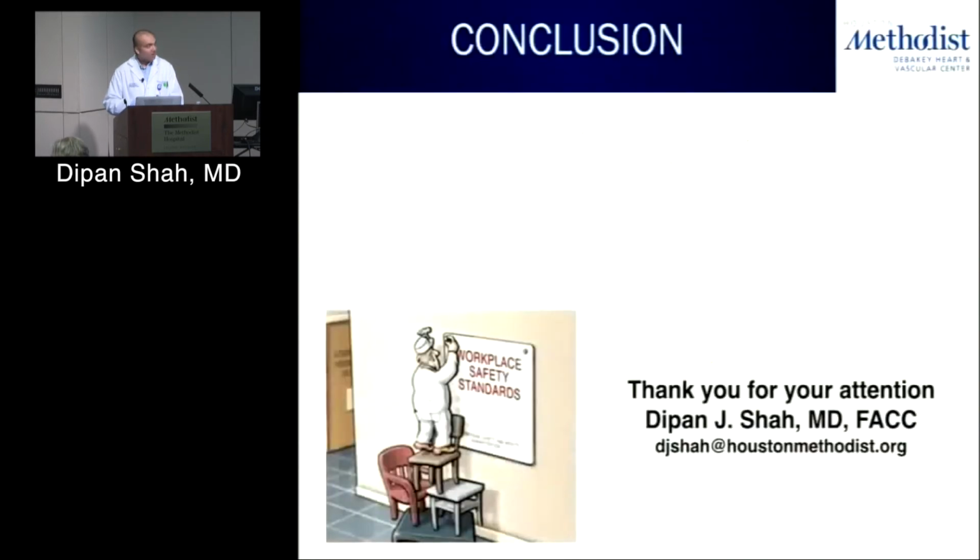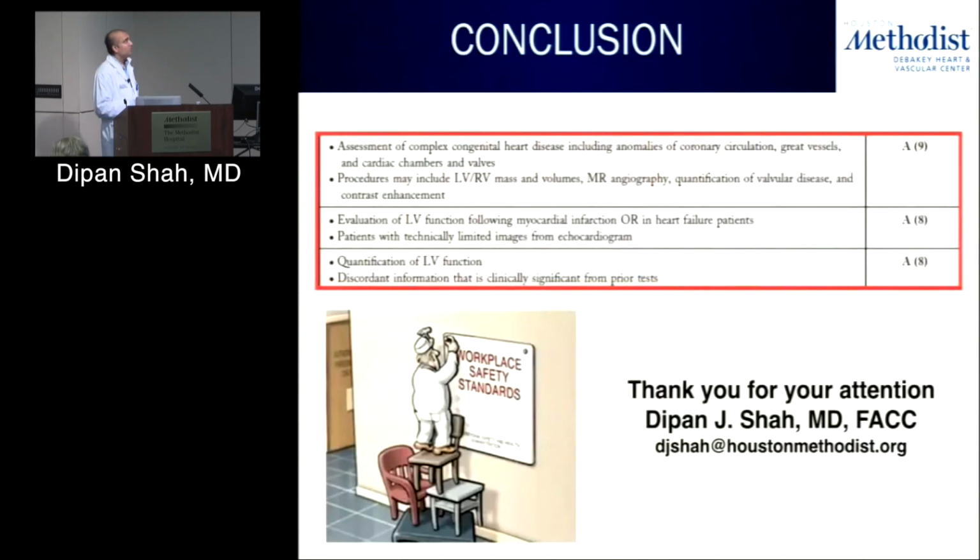So again, to kind of summarize, what's the clinical role of CMR for LV function assessment? Obviously, if you've got a situation where you need to quantify LV function and you have discordant information between prior tests, if you have a patient who has had a prior MI or heart failure and who has technically limited echocardiographic images, and then for patients with congenital heart disease, we didn't get a chance to get into this, but especially for the RV, CMR has optimal ability to quantitate both RV volumes as well as RV ejection fraction.